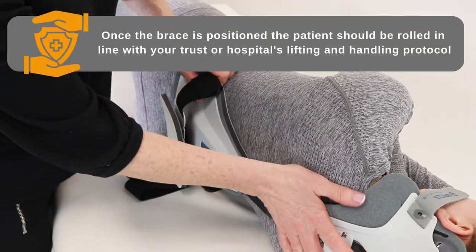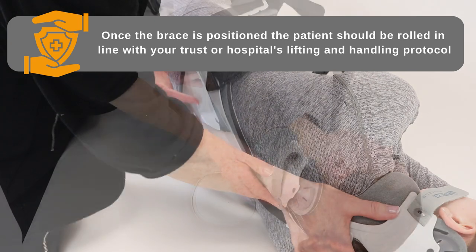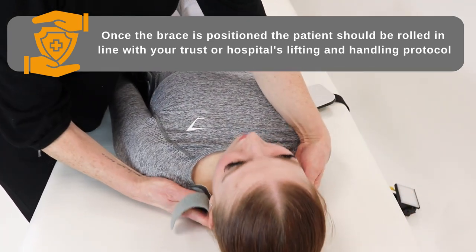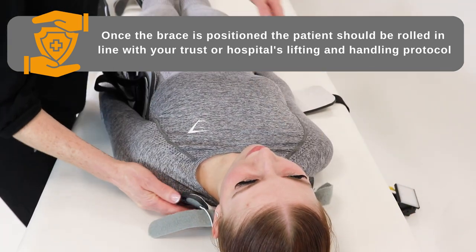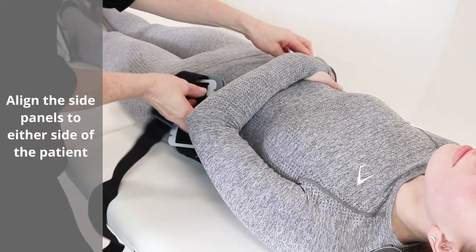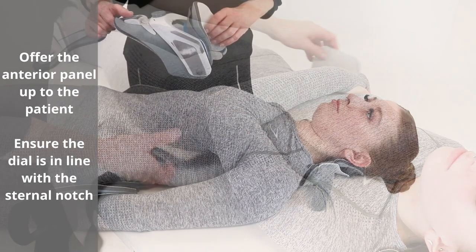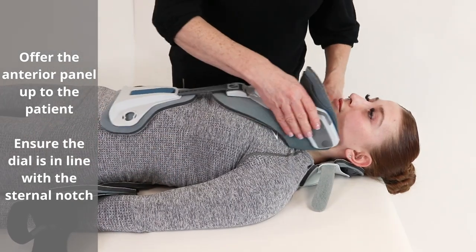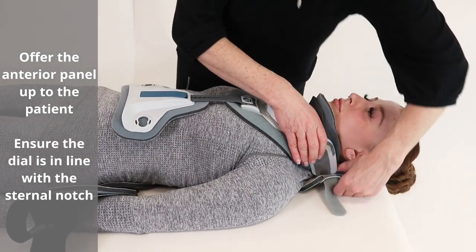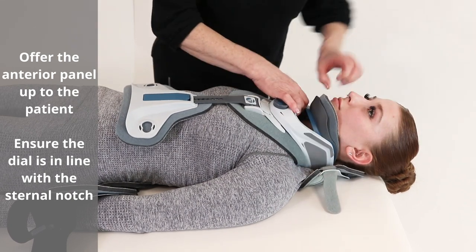Once the brace is positioned, the patient should be rolled in line with your trust or hospital's lifting and handling protocol. Align the side panels to either side of the patient, then offer the anterior panel up to the patient. Ensure the dial is in line with the sternal notch.